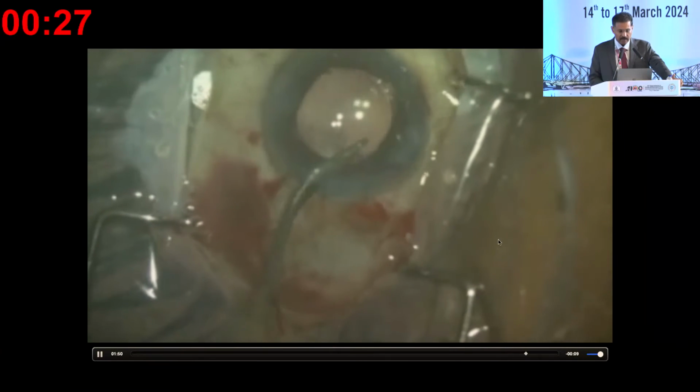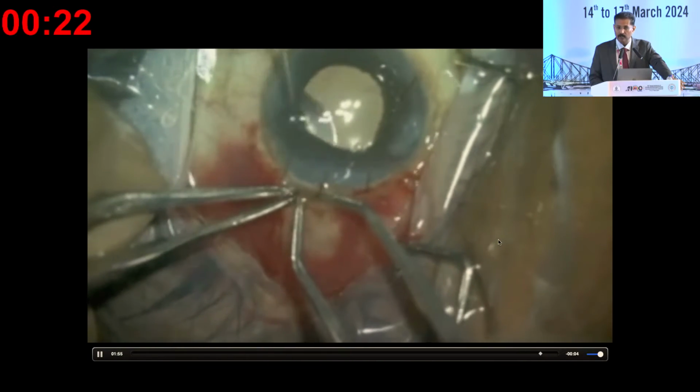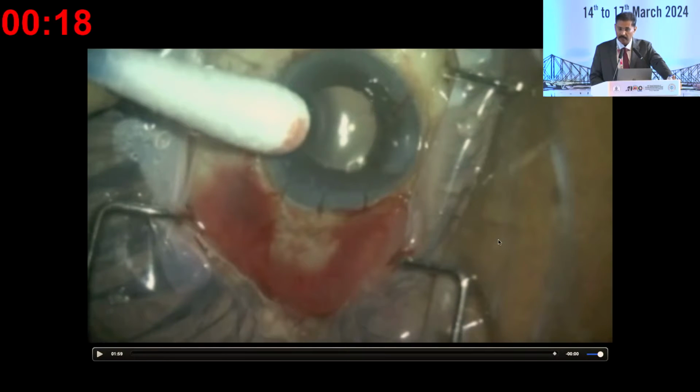So early recognition and the decision to convert, if you are in doubt to proceed with phaco, will give you the best results even in a PC rupture happening early in phacoemulsification. Thank you very much.